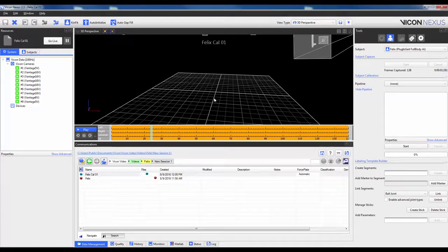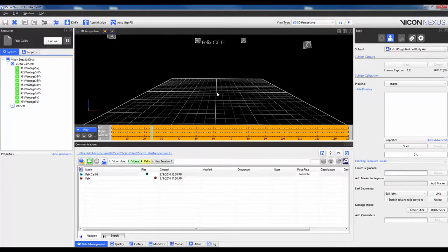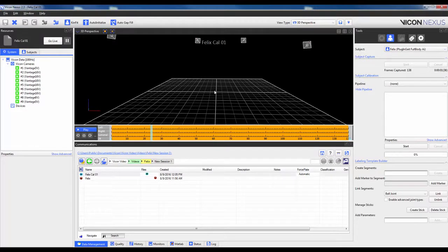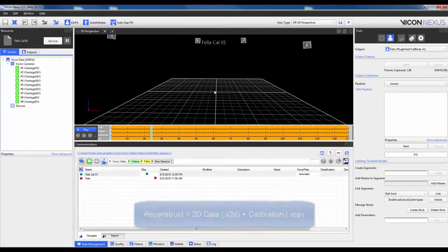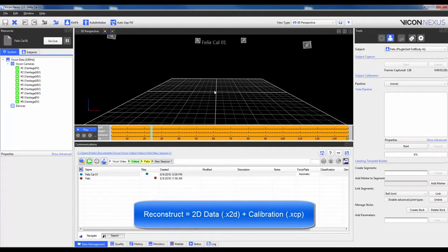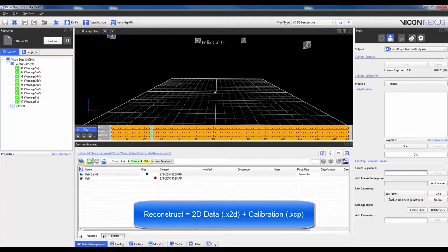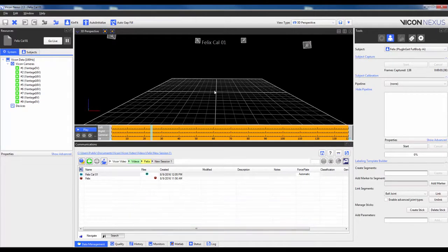So the first thing that you will notice in the Workspace View is that there are no markers. By default, Nexus will not reconstruct the markers for you. The term reconstruct refers to the process of combining the data from each 2D camera view with the calibration file to produce 3D marker coordinates.